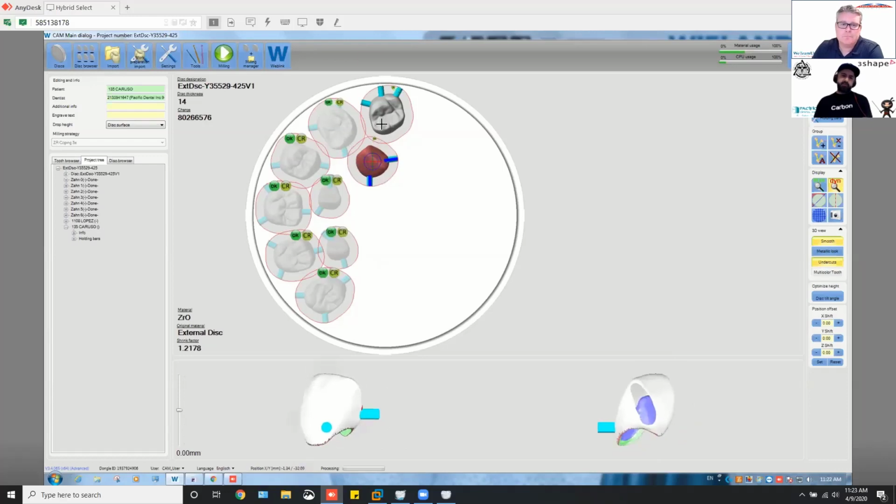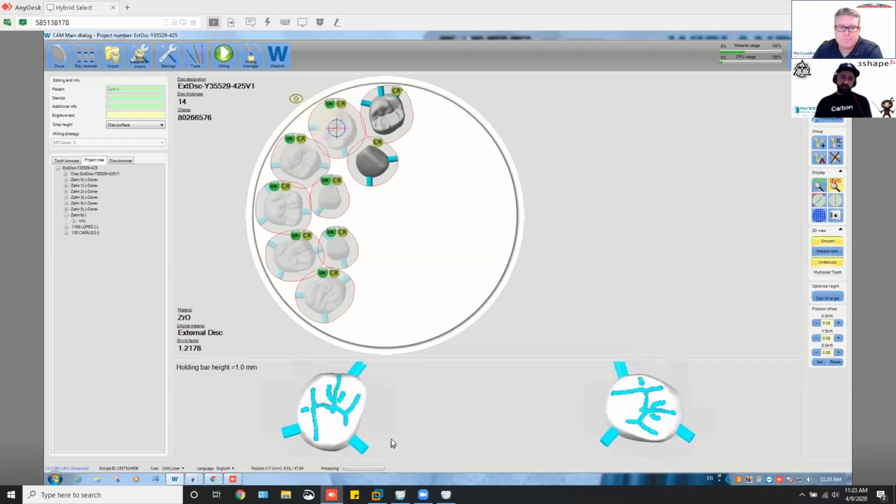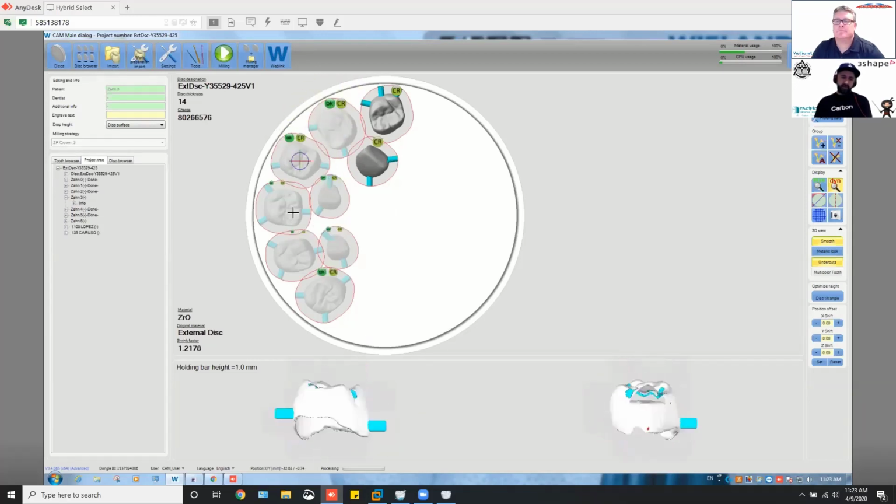But let me see if I can find one of these. Like you see how right here this is lower, and the facial side is taller. So I'm not going to sit here and put 3 screws right here. That's going to be an instant fail. And if it doesn't, well, I guess you got lucky and your tools were pretty good. But on certain cases, the triangle method is still key, and how to wax in place. Like this one, just to play it safe, I did it that way.